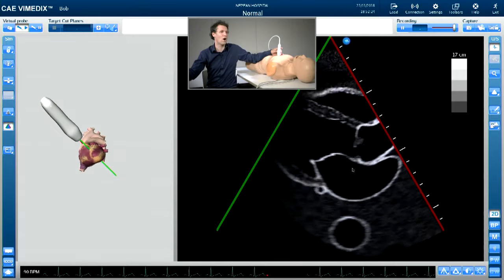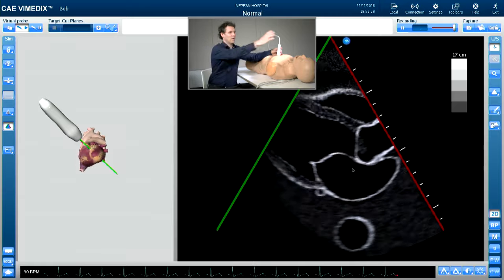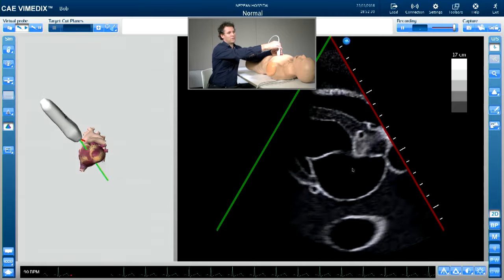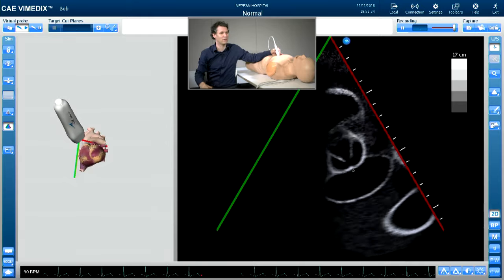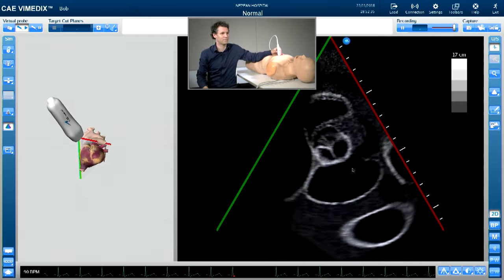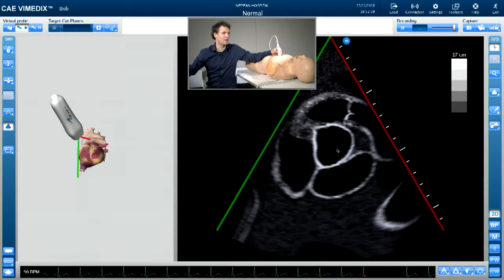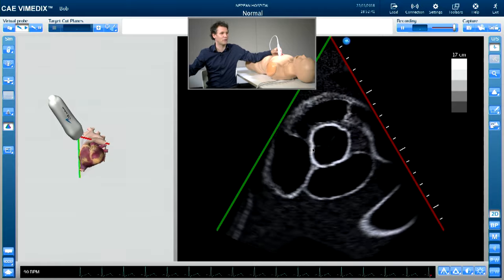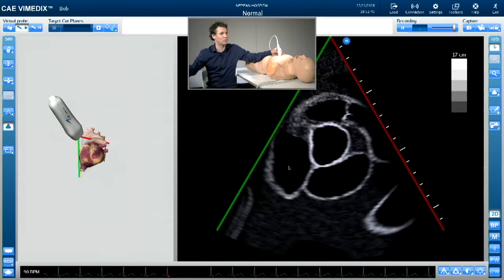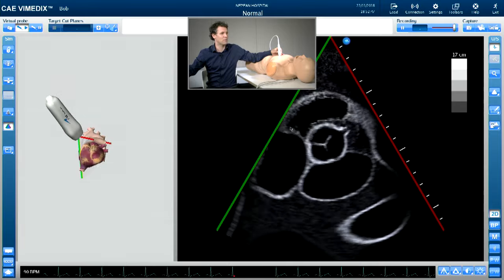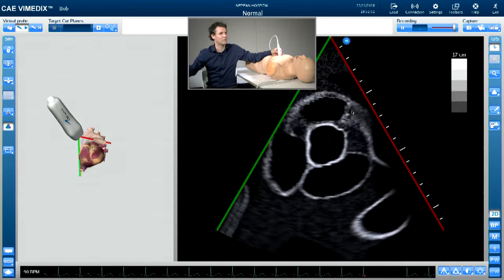That would conclude our parasternal long axis views. After that, taking our right hand, we are going to rotate 90 degrees and start at the level of the aortic valve. Here at the aortic valve level in a short axis view, we have the aortic valve in the middle, the left atrium, interatrial septum, right atrium, tricuspid valve, and the right ventricle flowing around into the pulmonary valve.